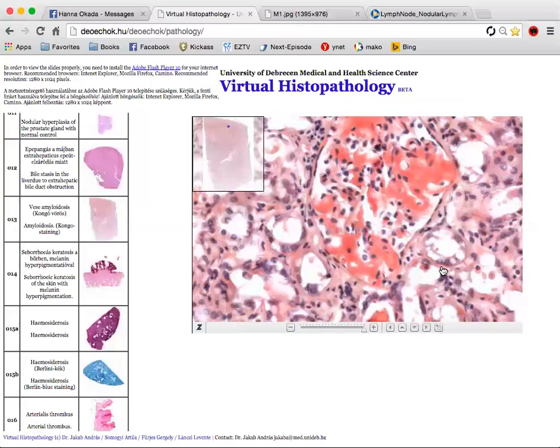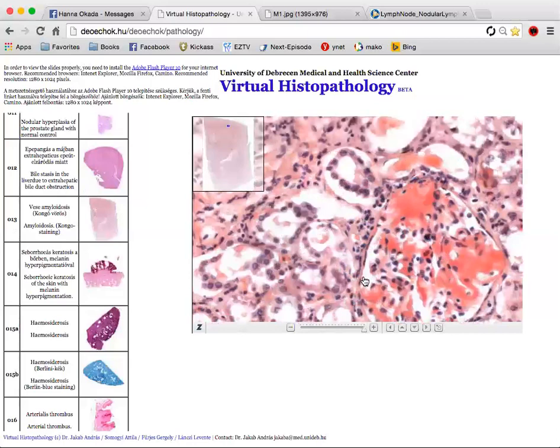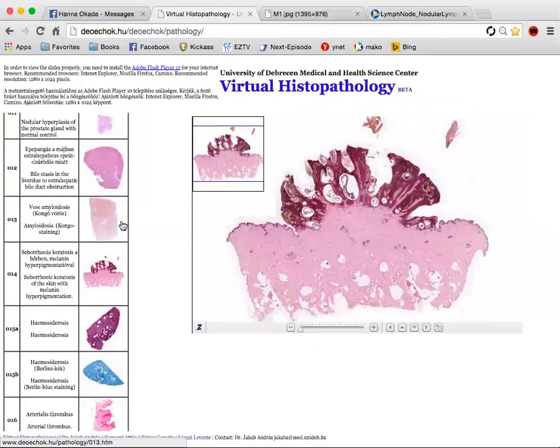Okay. So when we have amyloidosis, this area can be seen as darker or lighter. It's more red staining, but if you put it properly under polarized light, it would be very green. Okay. Right. So here they might ask you about amyloidosis. The lesion can be seen in the glomeruli, in the mesangium of the glomeruli, and in the wall of the afferent arteriole.